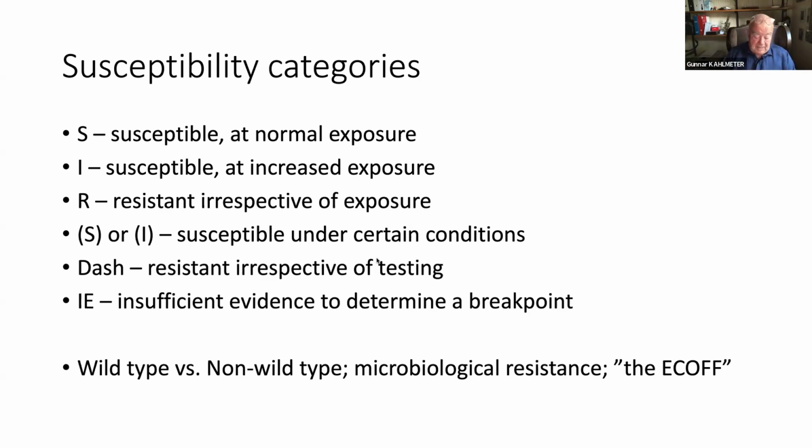An IE means that, yes, we have dealt with the breakpoint and the agent. There wasn't sufficient evidence to determine a breakpoint. And that leaves the field open for your own assessment if you need to do that. And then there is a document, among the guidance documents, called What to Do When There Are No Breakpoints. You can go to that document and you will have advice on how you can deal with agents where there is an IE in the table.